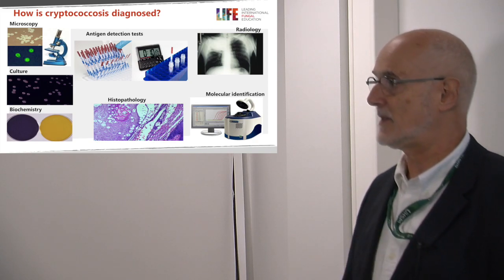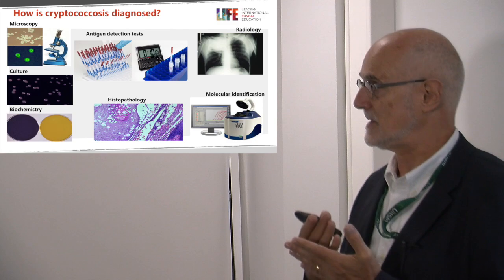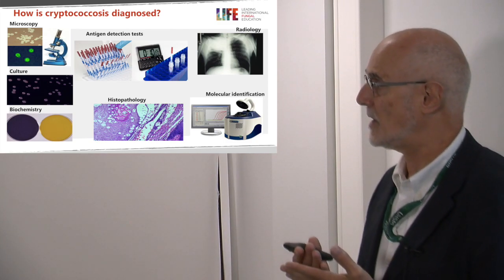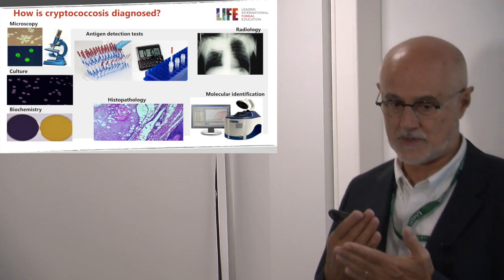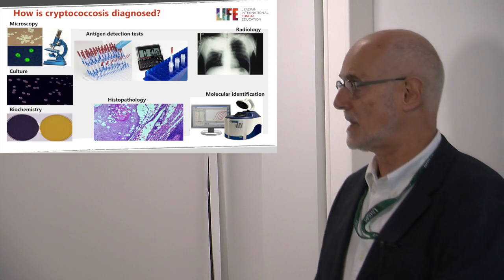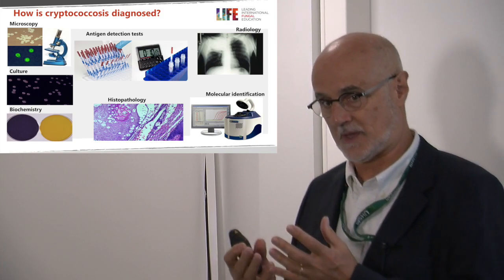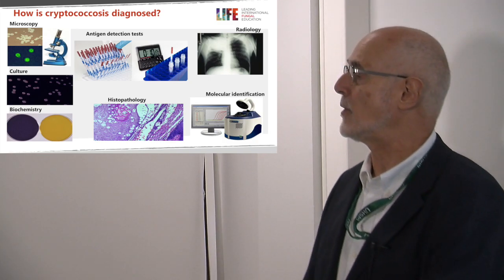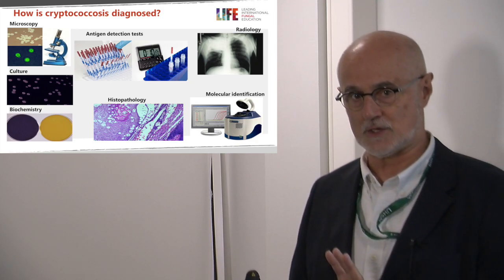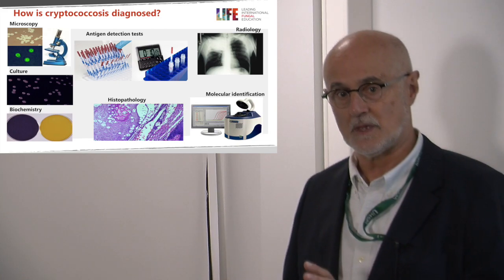But more recently we've had the development of the so-called lateral flow device. This is basically a dipstick where the membrane is coated with an antibody to the organism, and the dipstick can be placed in a sample of cerebral spinal fluid, and if the test line becomes positive, we'll see a little bit more about this in a few minutes, but this has really radically changed the diagnosis of cryptococcosis in resource-limited parts of the world.